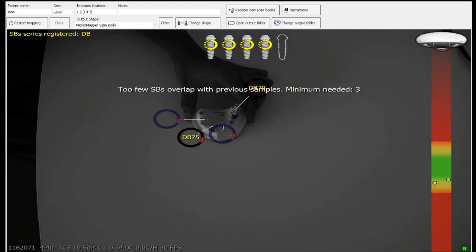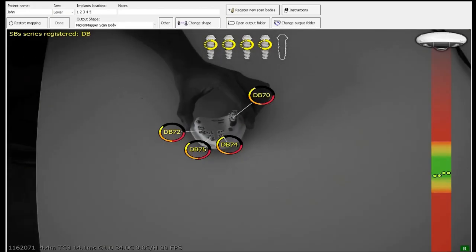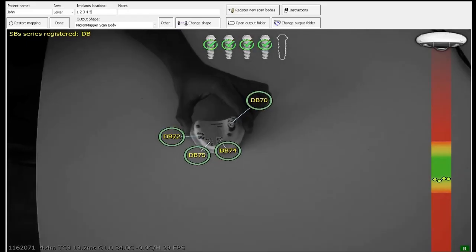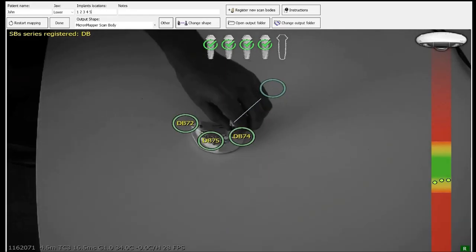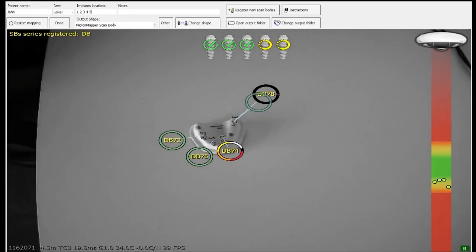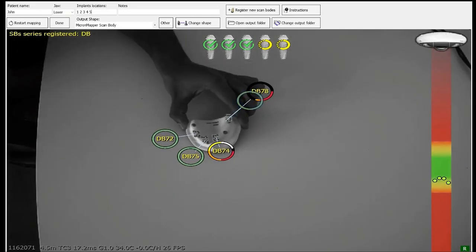Scan the scan bodies until the sampling circles turn green other than the number five as it is hidden. Don't click on done so the process will still continue. Now put the camera aside and remove the scan body in location four. So now the scan body in location five becomes visible to the camera.